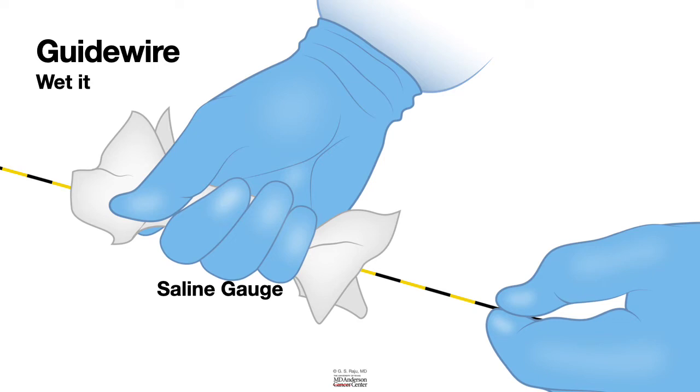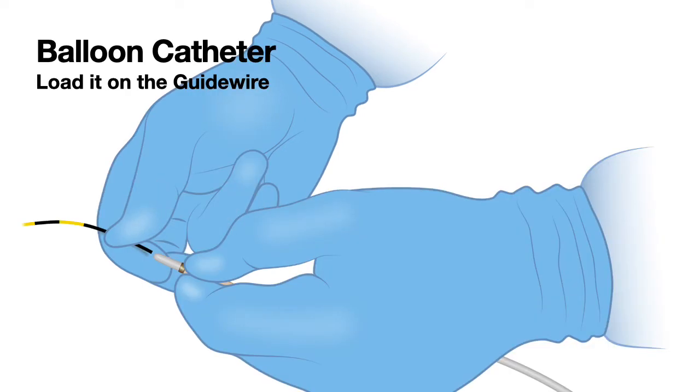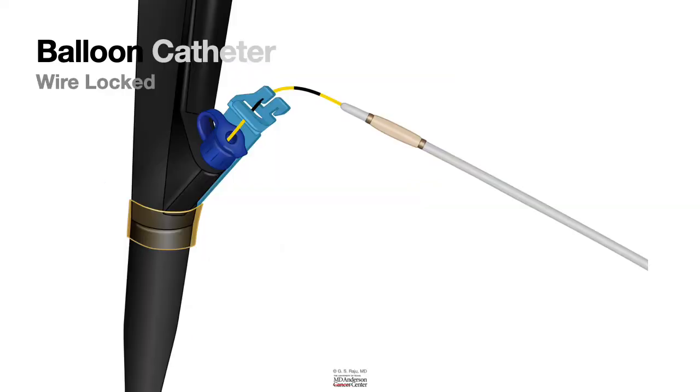Then load the guide wire into the balloon catheter, and once the balloon catheter comes closer to the wire that is locked, unlock the wire and allow the balloon catheter to go in.